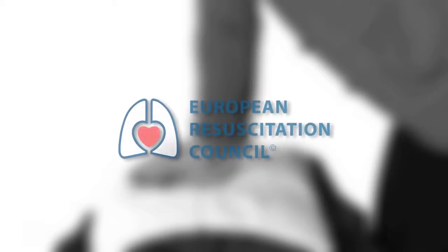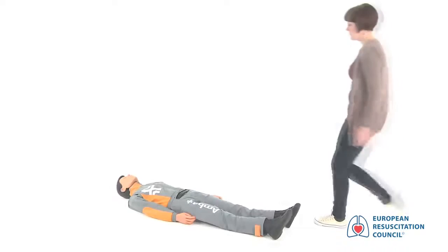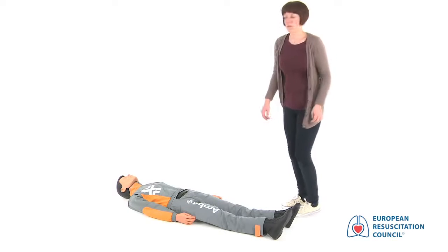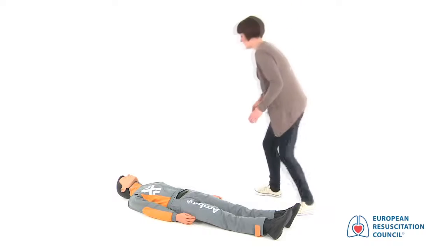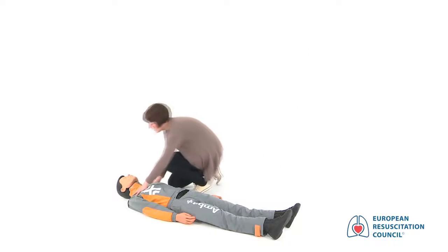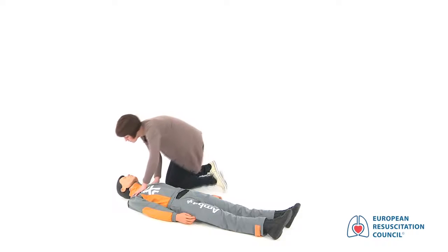Now that you have seen a demonstration of how to perform CPR and use an AED, we will go through the actions again, but this time I will explain what you should do. First, look for danger. If there is no danger to you, the victim, or bystanders, kneel beside the victim. Place the victim on his back, on a firm surface.